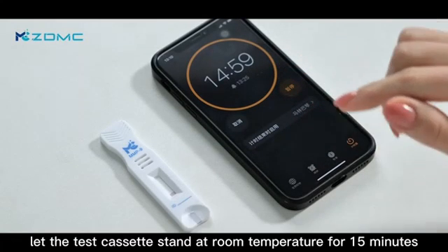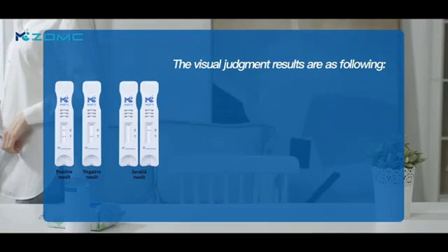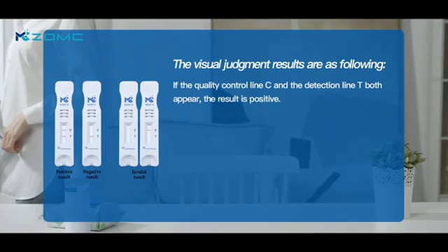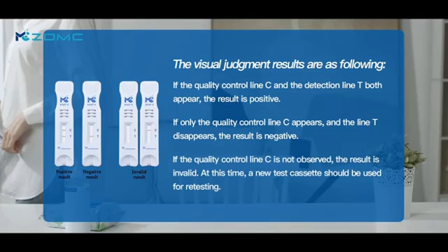let the test cassette stand at room temperature for 15 minutes. The result judgment is as follows: if the quality control line and the detection line both appear, the result is positive. If only the quality control line appears and the detection line disappears, the result is negative. If the quality control line is not observed, the result is invalid.